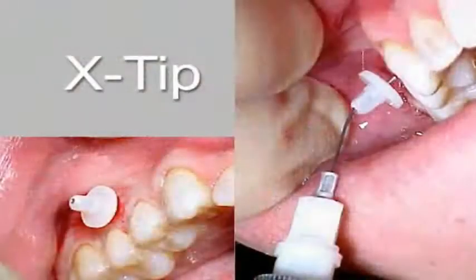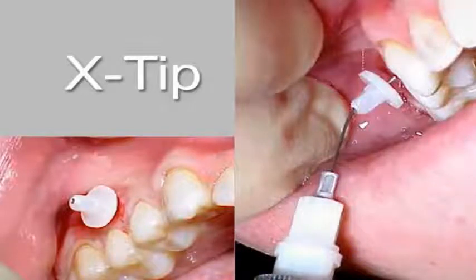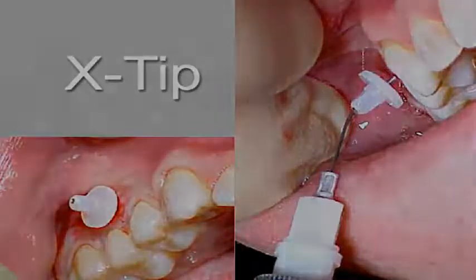The X-tip is a combined perforator and a sleeve through which the needle is placed. This is generally effective and simplifies needle positioning. One problem is that there is a greater likelihood for anesthetic leakage around the opening and into the oral cavity.